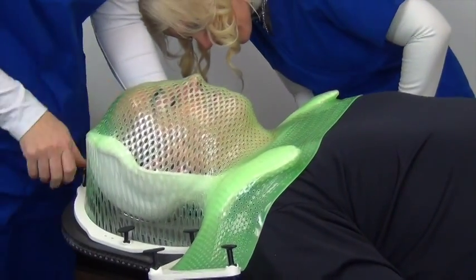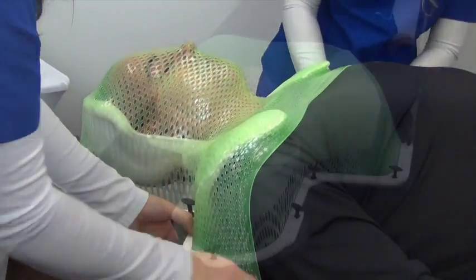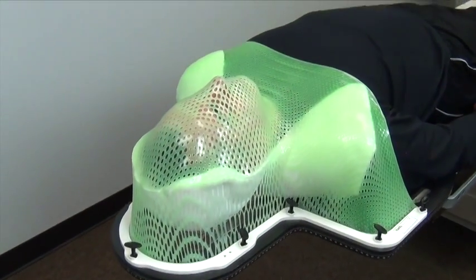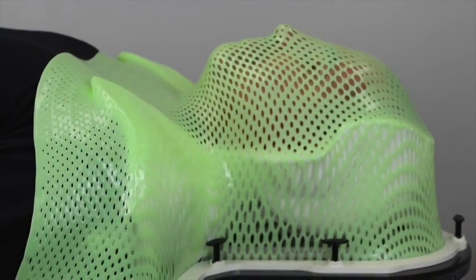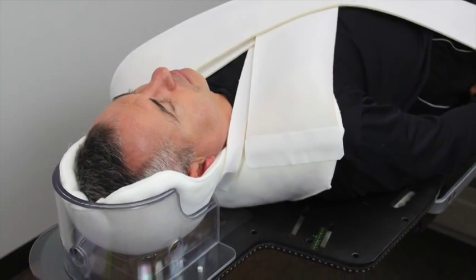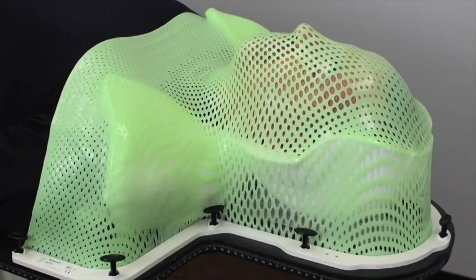Clarity offers shell systems to fit overlay boards from Civco, Orfit, Q-Fix, and all standard manufacturers. Each kit can be used for head and shoulder or head only immobilization. We recommend using the shell system with the Clarity Green Thermoplastic Masks. The non-stick coating and longer cooling period will provide you with plenty of time to create the perfect immobilization device for your patient, leaving you with a complete, fully encompassing, and ultra precise head support system.